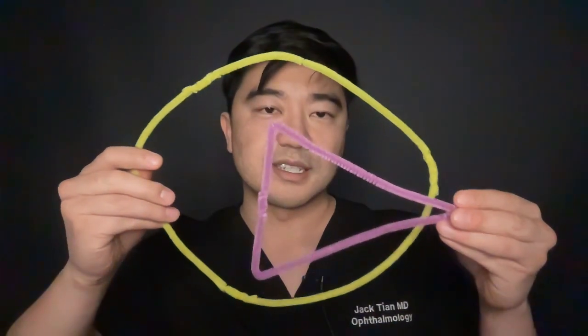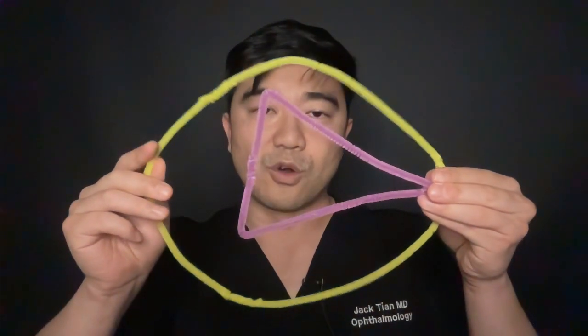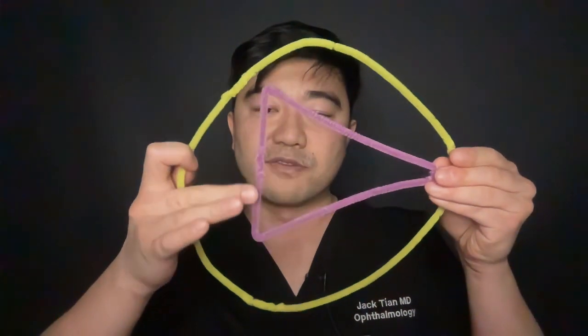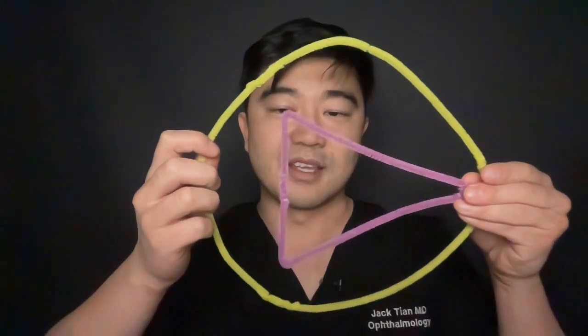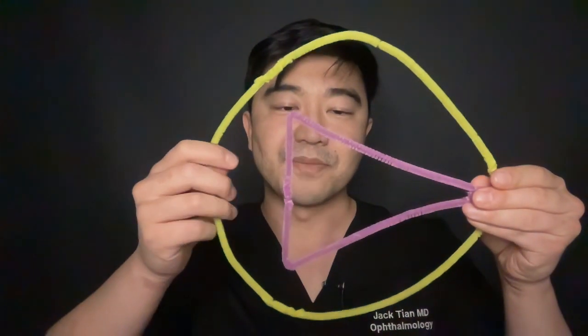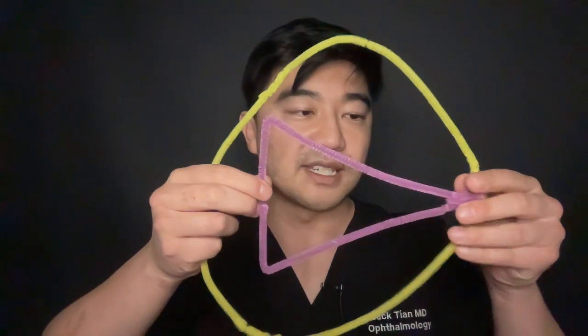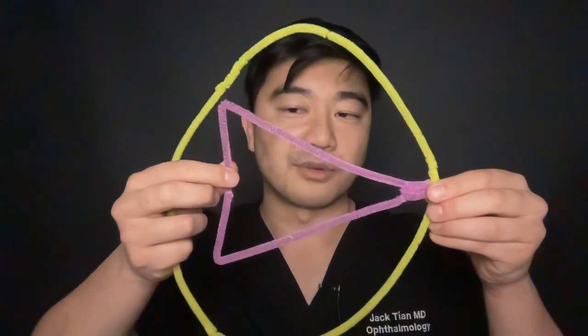Again, this is a cross-section of the eye, and this is the front of the eye, the cornea. This is the back of the eye, the retina. Let's assume this vertical line, in the purple, is the lens, and that the two sides are focusing light here on the retina perfectly.